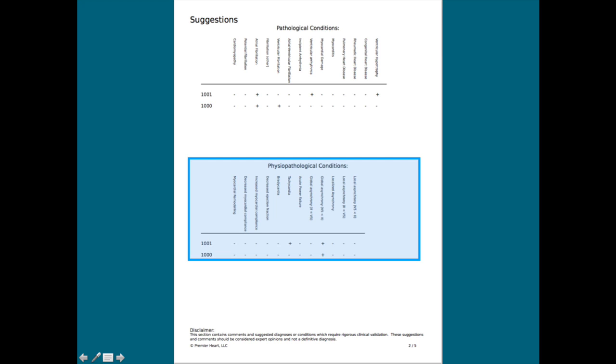Patients presented with the following secondary or tertiary findings, such as the presence of myocardial damage, ventricular arrhythmia/fibrillation, global or local asynchrony, myocardial remodeling or ventricular hypertrophy, lowered ejection fractions, or combinations of these conditions should be referred to a qualified cardiologist or electrophysiologist who readily accepts the MCG's report in an expeditious manner. Periodic follow-up with the patient using an MCG personal monitoring unit to oversee progress on a regular basis is also recommended, as well as changing the patient's treatment course as necessary in consultation with your patient and the cardiologist or electrophysiologist that they are seeing.